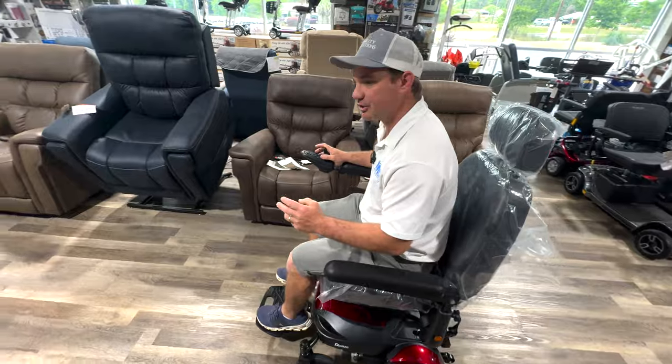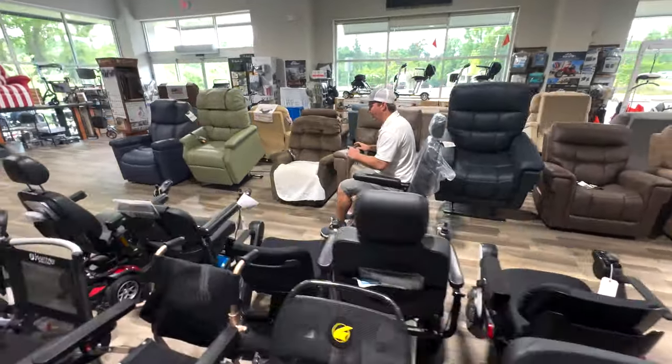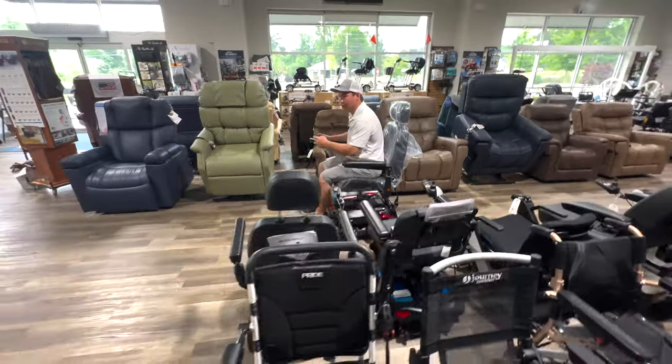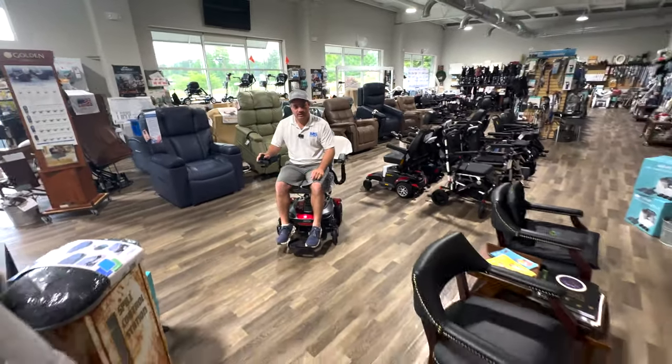Note that the chair will be a little bit slower in the elevated position, so if you need that speed, bring it all the way back down and you'll get full control of your speeds. Let's go into this bathroom.